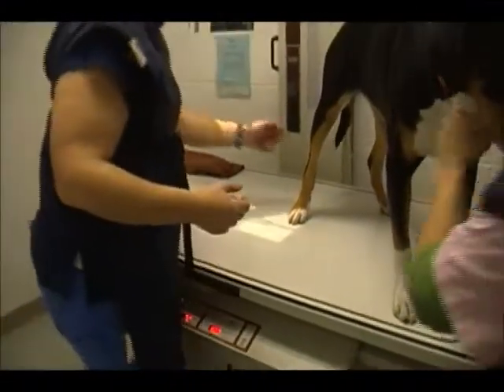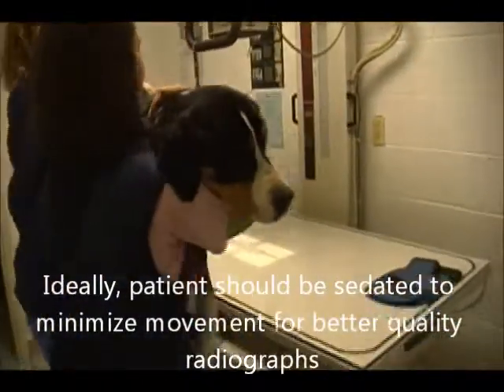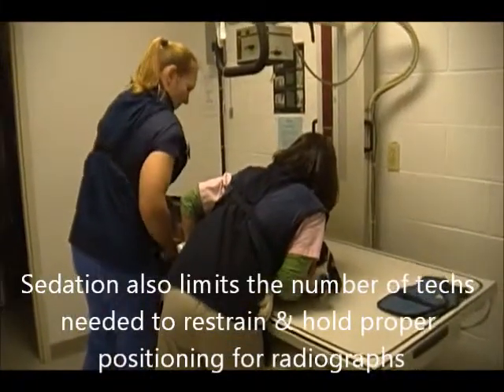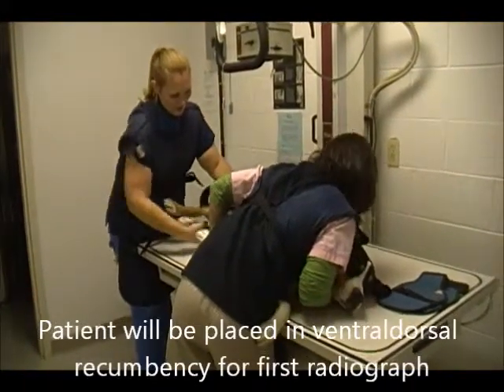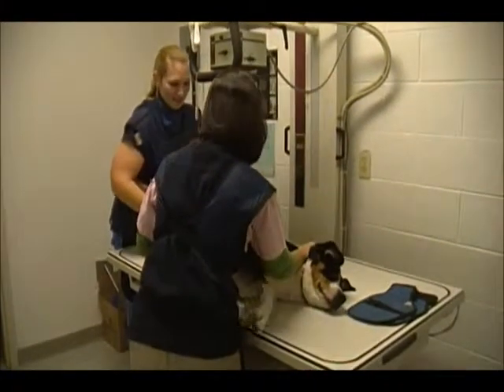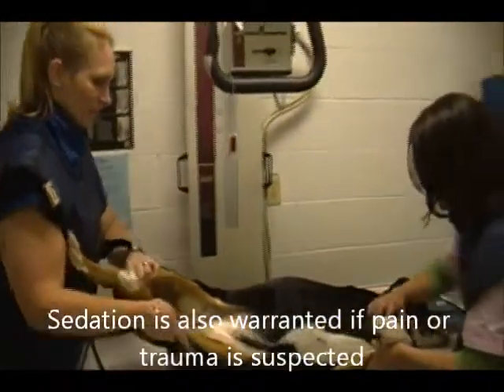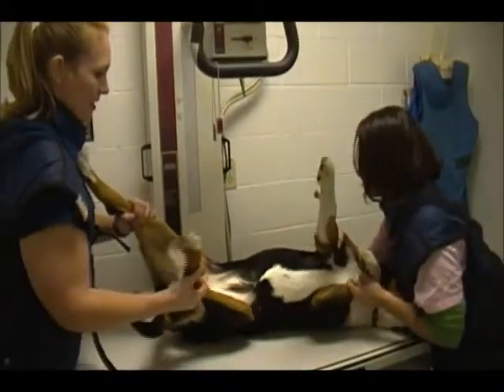I'm going to position the patient here. Normally this would be done on a sedated patient to help reduce the personnel needed to restrain. We're going to position her in DV.